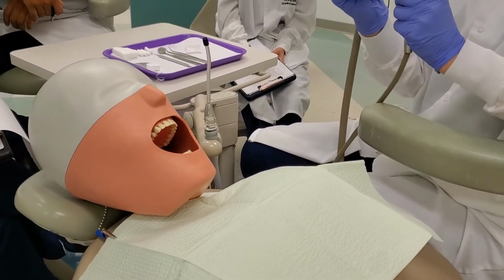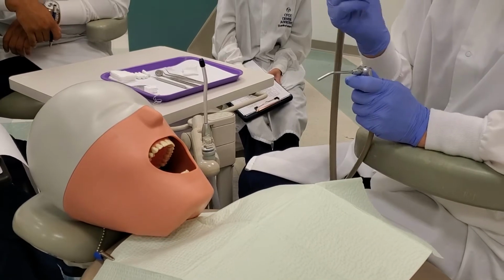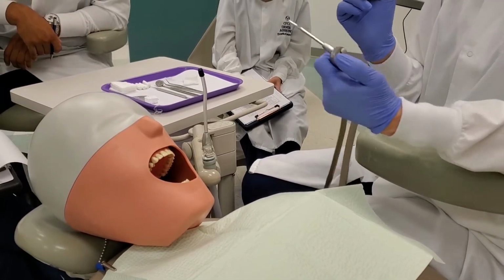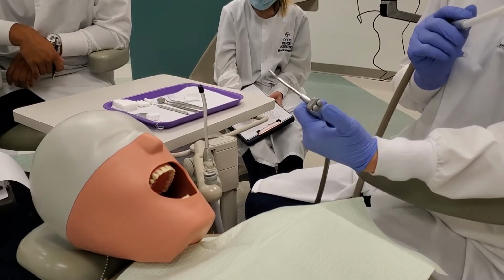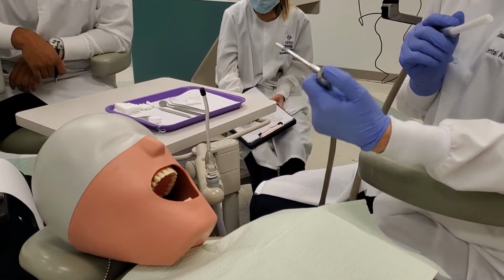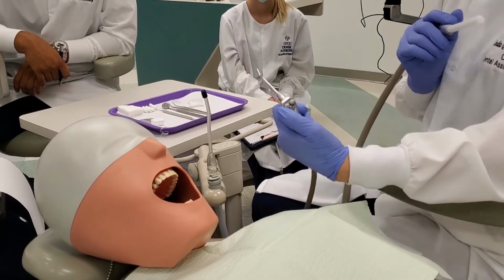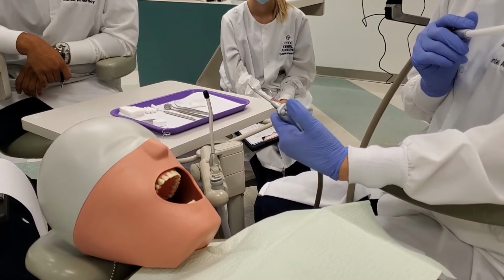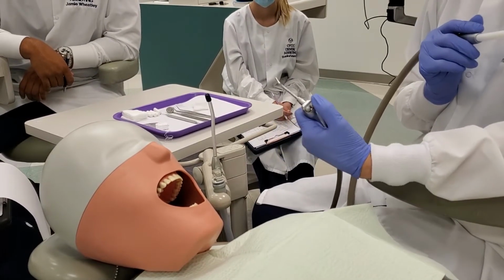So I'm going to give you a tooth number. Okay? You're going to rinse and dry a mandibular tooth using the water, the air and water, and then just the air. So when you have the air water together, you hit both buttons at the same time. It's giving it like a pressure wash. Okay, so you have the water by itself, air and water, pushing them both together, and then just the air to dry the tooth.